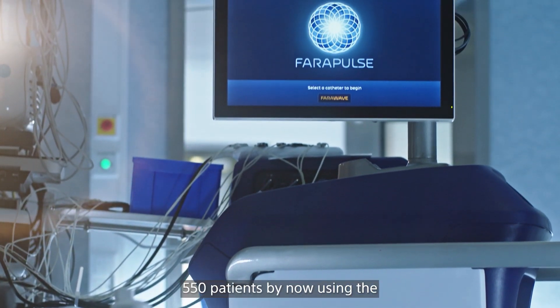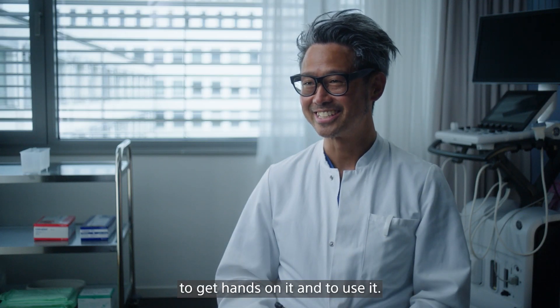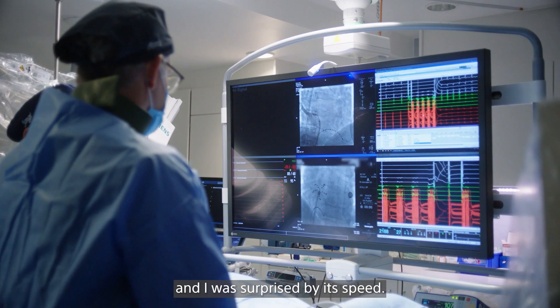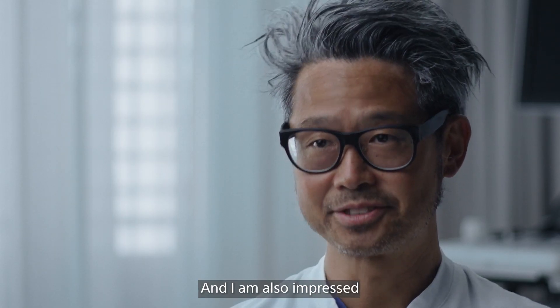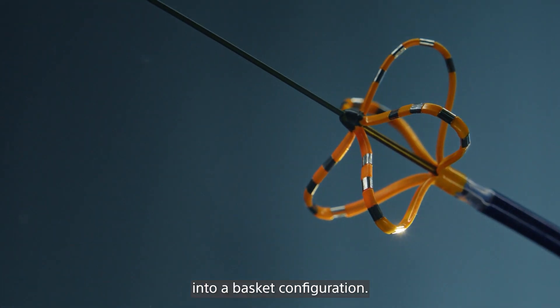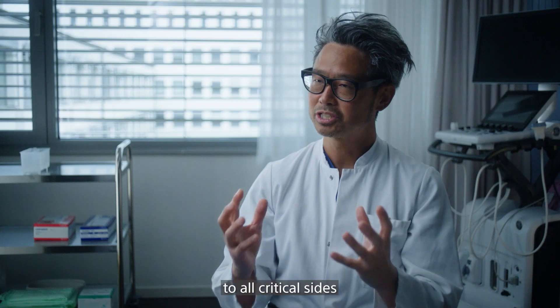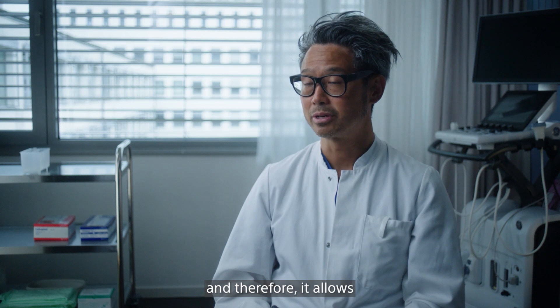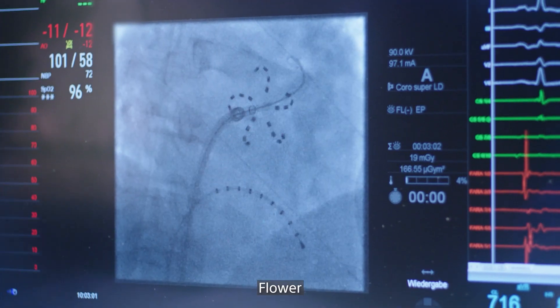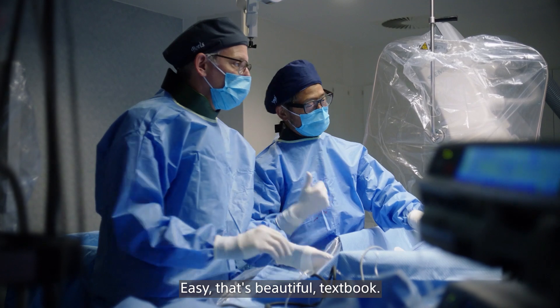We have been treating, I would assume, 550 patients by now using the Farapulse device. I was really looking forward to getting hands on it and to use it. I was convinced it may offer a major advantage for patients, and I was surprised by its speed. I am also impressed by the durability of lesions which we have observed. It goes from this flower into a basket configuration, offering the potential to really get a nice position and full contact to all critical sides of the pulmonary vein, allowing for very efficient ablation at each pulmonary vein.